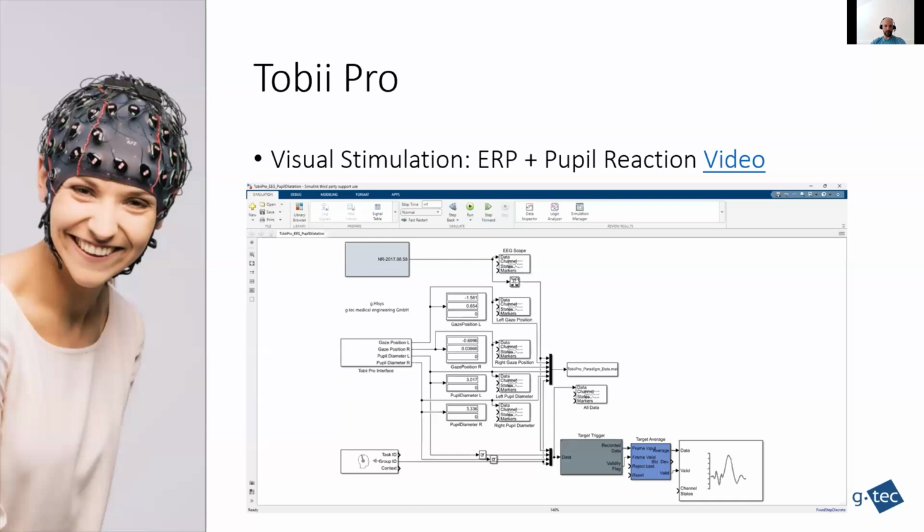Important to say here is that we don't have any sensors or any other detectors which are detecting the onset of the stimulation. The paradigm presenter is implemented in a performant and smart enough way that it exactly knows the onset of the visual stimuli. So we don't need any external triggers.